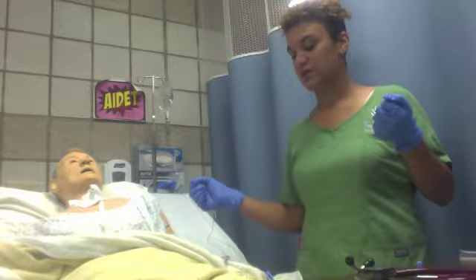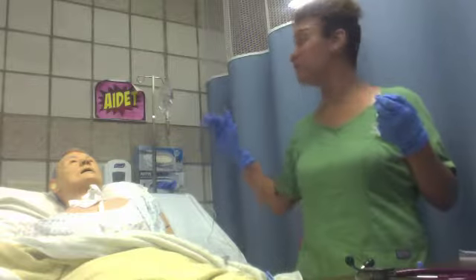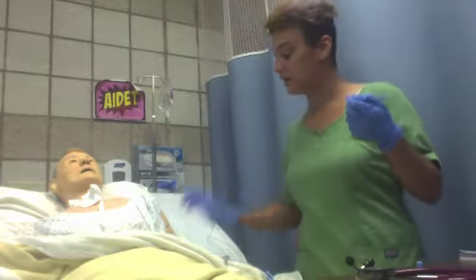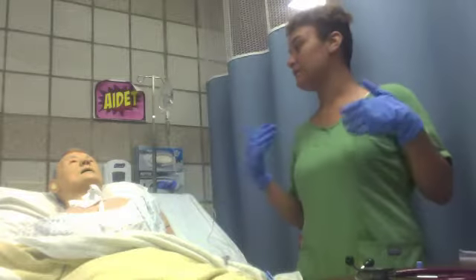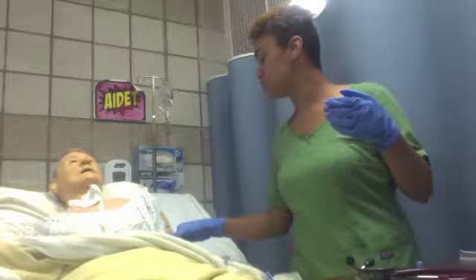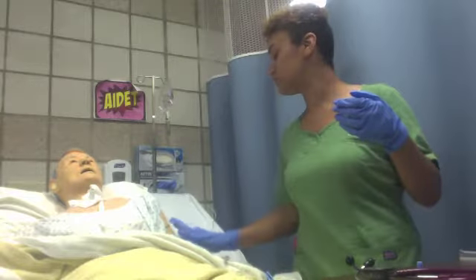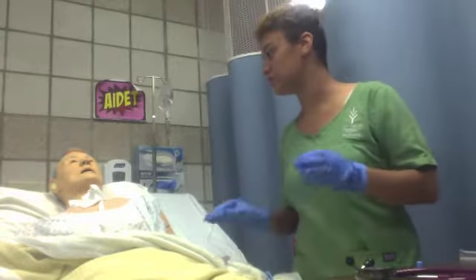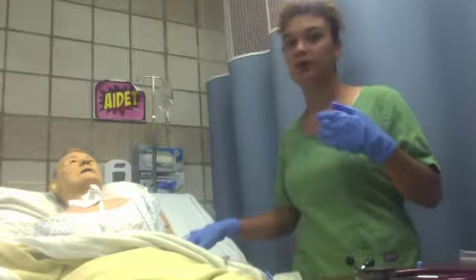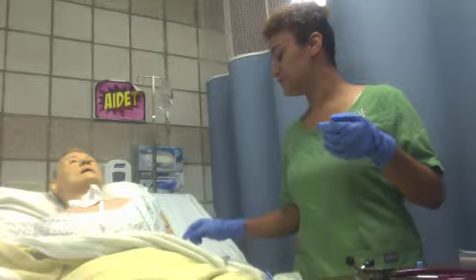Okay, so that was a check of the IV, the bag, the line, and the dressing. What I was looking for, like I said, was just making sure that your dressing looks good. I want to make sure that the dressing stays on. If you notice any moisture or bleeding inside of it, you let us know. If it starts to feel painful, it should not feel painful, so you just let us know.